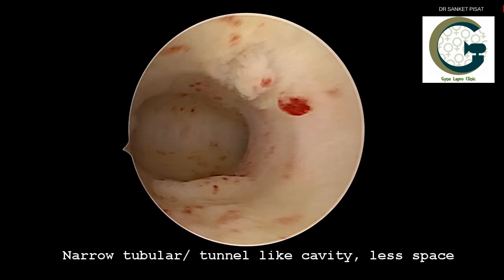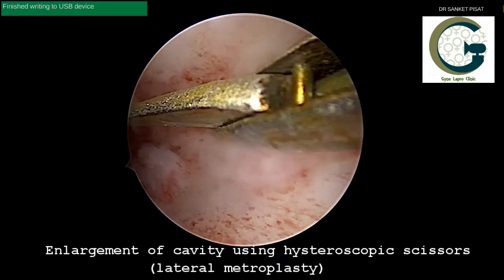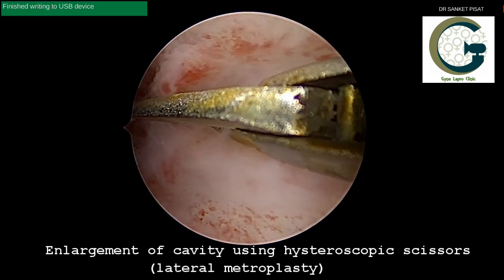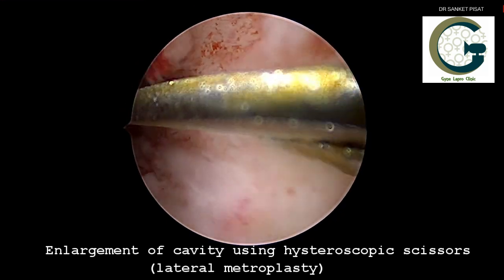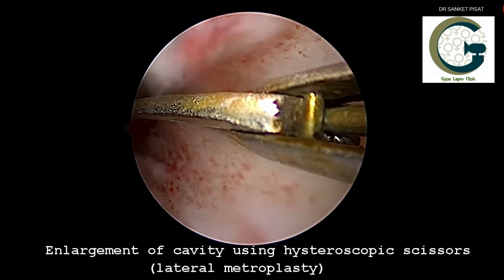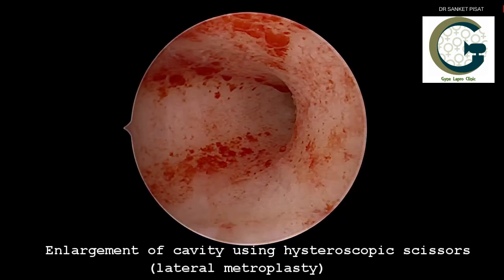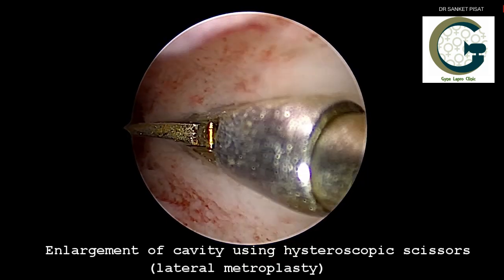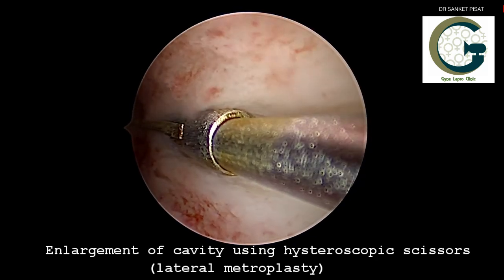The treatment for this condition is a surgery called hysteroscopic lateral metroplasty — enlargement of the cavity using hysteroscopic scissors. Gentle cuts are made on both side walls of the uterus where the uterine tissue seems to have overgrown, and gradually this wall is leveled until it reaches the level of the surrounding uterine muscle.